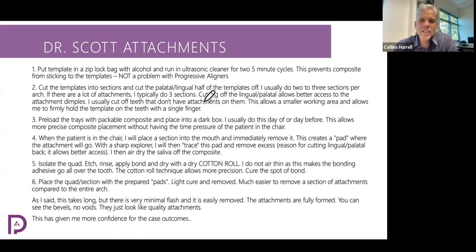Now, this is a technique I haven't used, but he likes to cut some of the lingual or palatal part of the template away, giving better access to the little wells or dimples that are on the facial side so that he can work with that area, which is where the composite is going to go. Okay, so he likes to trim some of that off. And he says this allows for a smaller working area and allows me to firmly hold the template on the teeth with a single finger.